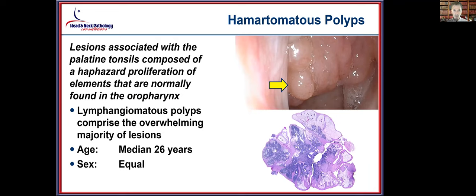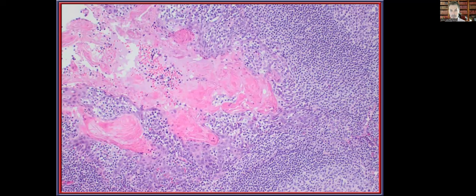Hamartomatous polyps are associated with the palatine tonsils, specifically a haphazard proliferation of elements normally found in the oropharynx, associated with a lymphangiomatous appearance — the most common subtype. Multiple lesion types can produce hamartomatous polyps, but the lymphangiomatous one is most frequently seen. They generally present at a younger age without sex difference. Histologically, there is an abundant lymphoid infiltrate with very dilated vascular channels characteristic of the lymphangiomatous appearance.